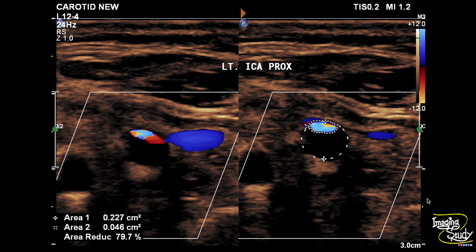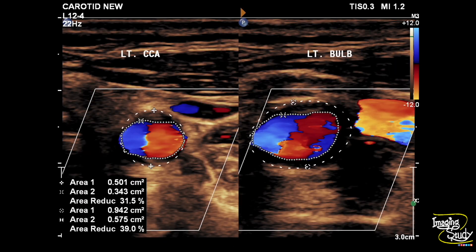We have also checked other areas. Here you can see the left common carotid artery and left carotid bulb showing mild luminal narrowing due to type 2 and type 3 plaques.